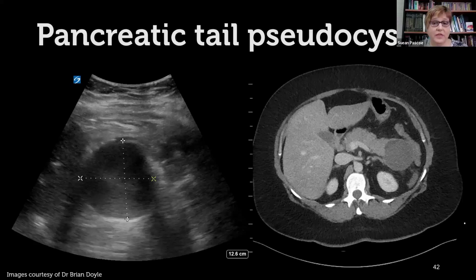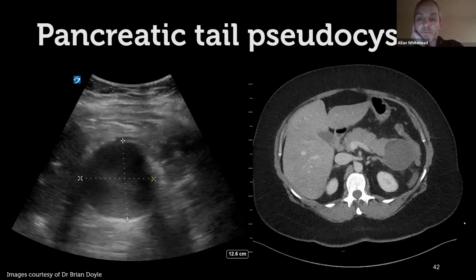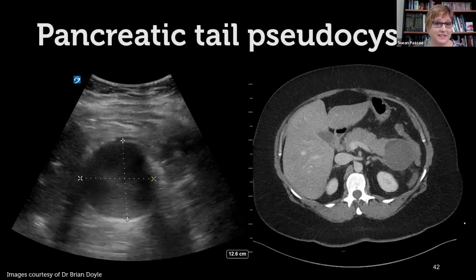And the good thing about that is you get to clinically examine your patient. I say this a lot: for you guys, ultrasound is just one piece of a 100-piece puzzle. If all the other pieces are pointing towards a picture that doesn't match your one ultrasound piece, you have to rely on your clinical instinct. And I think that's really important. It doesn't matter what part of the body you're scanning. You're a doctor first before you're a sonographer. If the ultrasound is not agreeing with everything else that you're getting signs and symptoms from, then you've got to trust what your signs and symptoms are telling you.